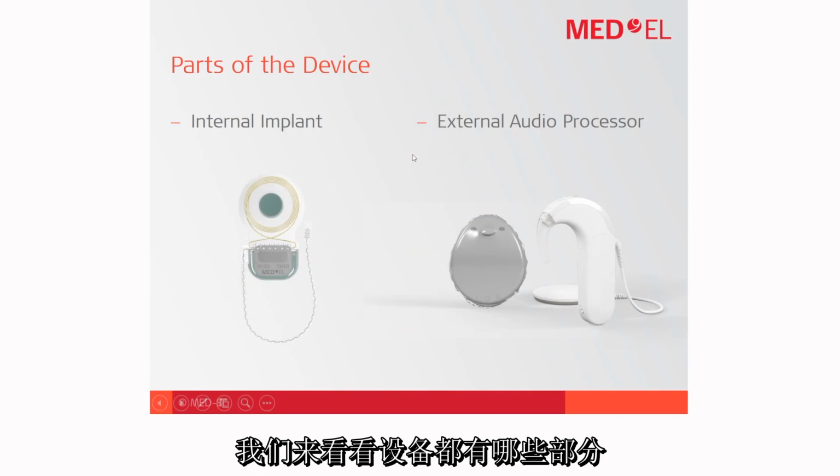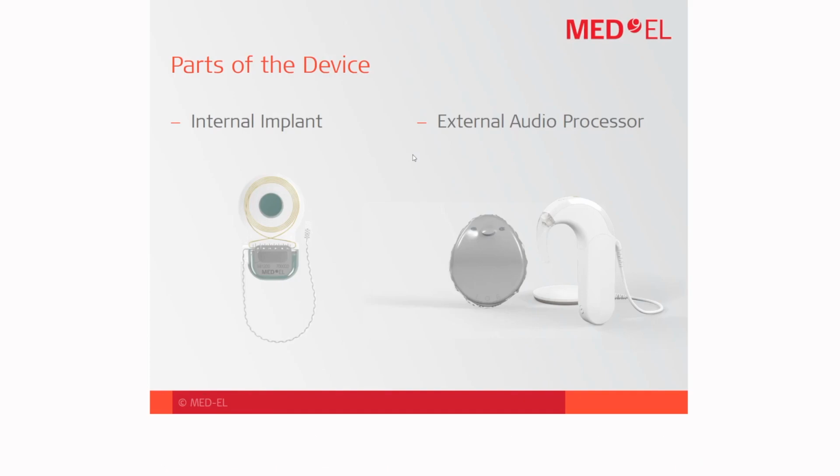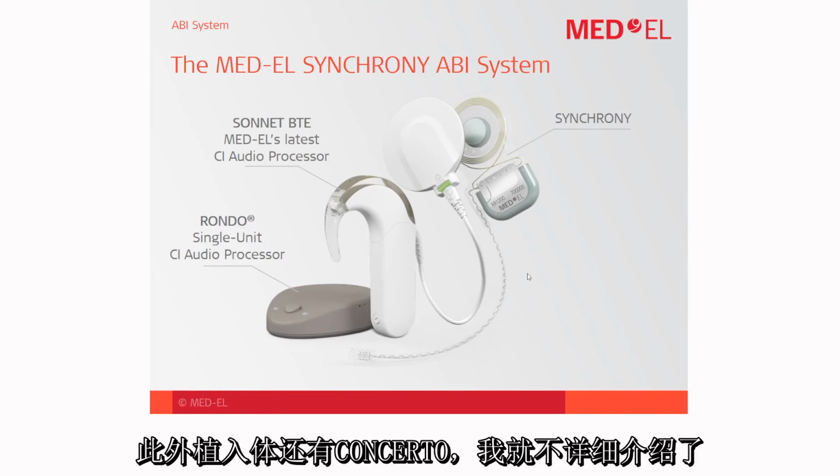What are the parts of the device? You have an internal implant and an external audio processor. For this presentation, I'm going to be focused on the MED-EL Synchrony ABI system. So the Synchrony ABI implant that you can see here, and also the Sonnet and Rondo audio processors. Although the ABI is also available in a Concerto implant, we're going to be talking about the Synchrony here.